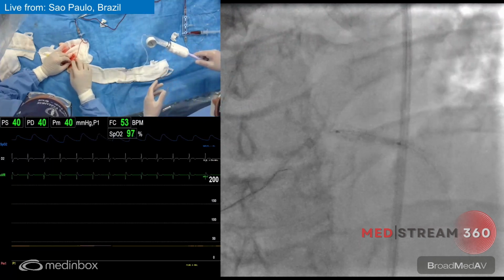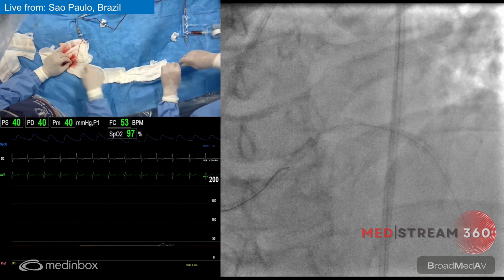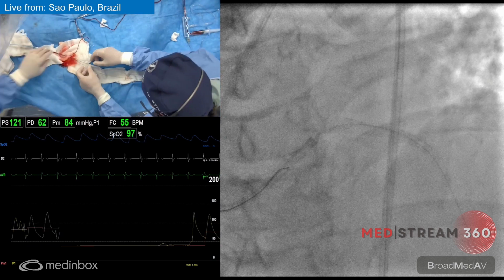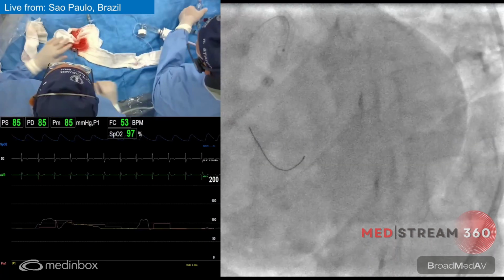So really going up to pressure, right? 28, 30, right, Rodolfo? 30. 30, okay. Very good. So bringing back now the trio balloon, and we go to the POT balloon now. And we have a 4.5 by 12. 4.5 by 12, okay.